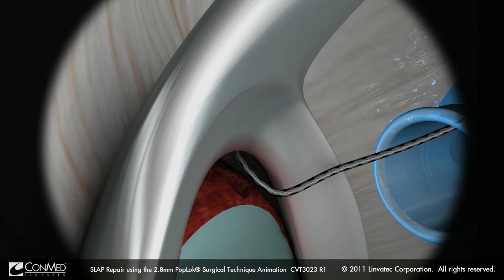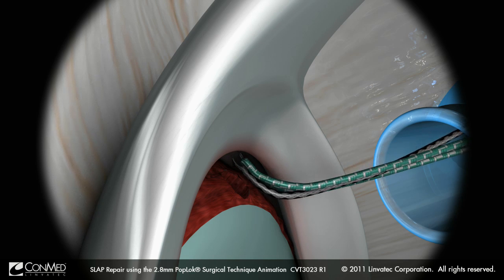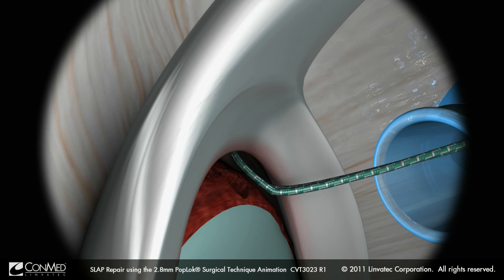Using a 45-degree Spectrum 2 hook and a Super Shuttle Relay, one end of a needle-free Hi-Fi suture is passed through the labrum from the articular side medially, just anterior to the biceps tendon.